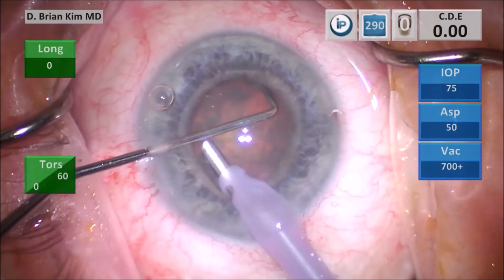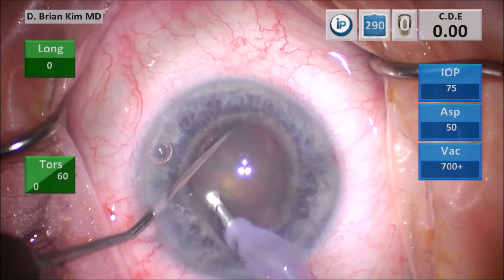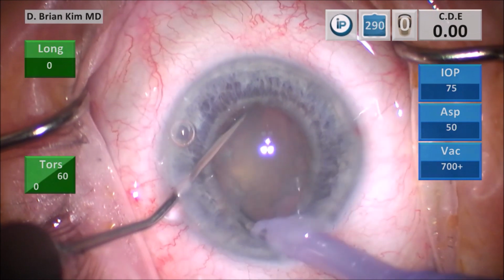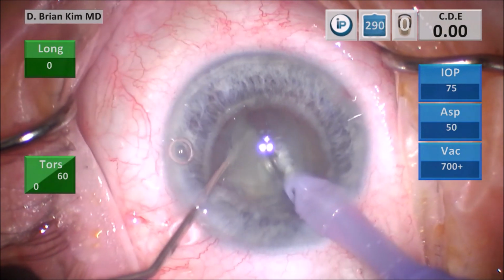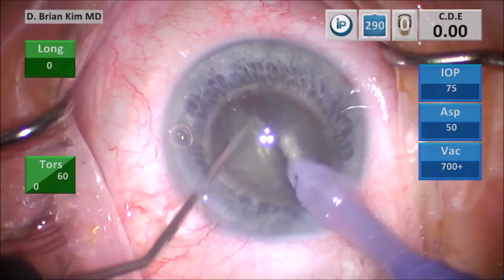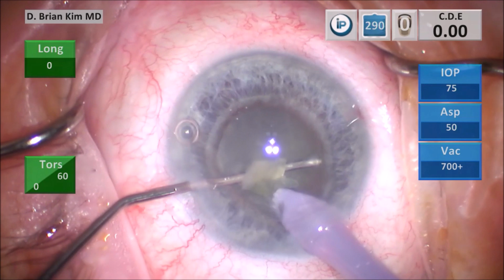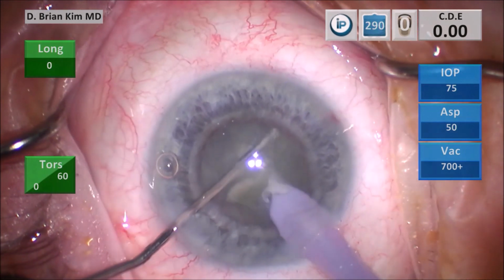I go underneath the epinuclear material, slide the chopper out with the leading edge being the tip. I rotate and supinate my hand, and I make sure I get down into the capsular fornix. I turn the phaco tip more vertically and subincisionally. I bring both instruments together, crushing the densest and most central portion of the lens, and the lens crushes and divides very easily.